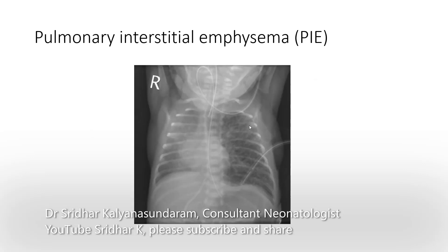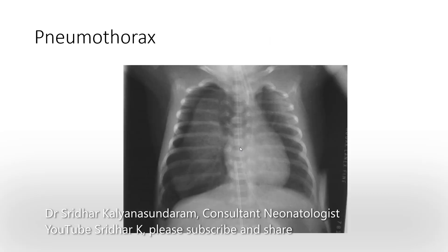This X-ray illustrates pulmonary interstitial emphysema. This is not seen that commonly these days because of the regular use of antenatal steroids and early appropriate ventilation without overdoing the pressures. This baby has a chest drain, so it probably had a PIE-associated air leak as well.